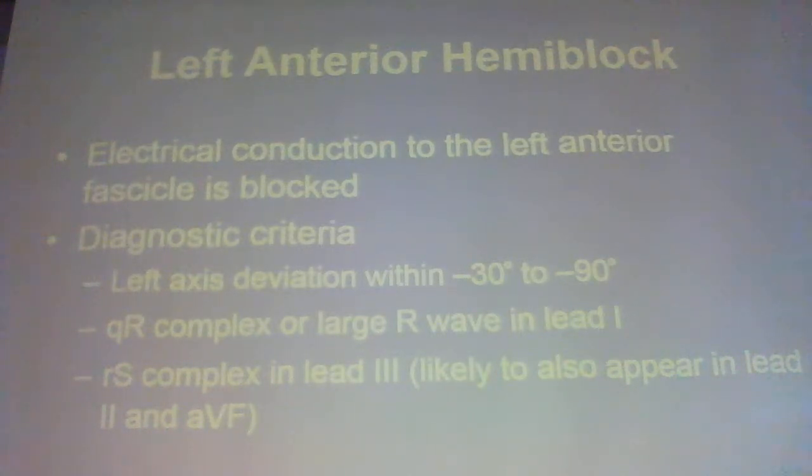So if you look at your picture there, or the colored picture, you can see what you're going to see on that 12 lead. So the color picture with the 3 or 4 on it is probably the best thing to look at when you're looking at fascicular blocks.